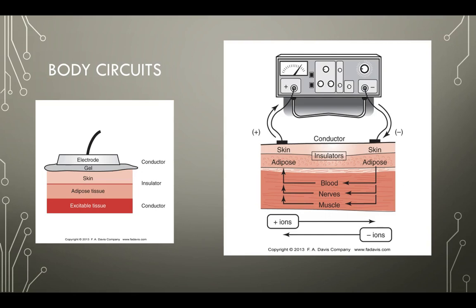So if we said that skin is a really poor conductor, more of an insulator, there are certain areas of the skin surface that are more prone to allow electrical activity to enter. Those are what we call stimulation points. There are three major types of stimulation points, areas of the skin that have decreased electrical resistance. There are trigger points, which are high areas of activity, usually for tension. You have motor points.